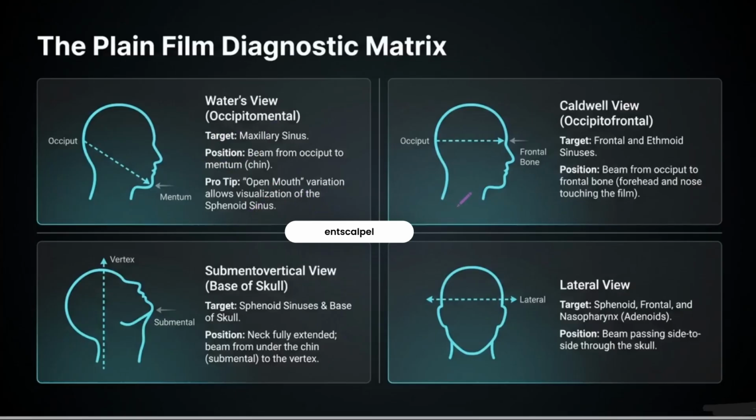Exactly. But if you take a knife and cut a thin slice, what they call a coronal cut, you can suddenly see the exact layout of every single air pocket in that specific millimeter of the loaf. And then you cut it horizontally, which is the axial cut, sort of like slicing a hamburger bun. Yeah, and you gain a completely different perspective of those exact same bubbles.